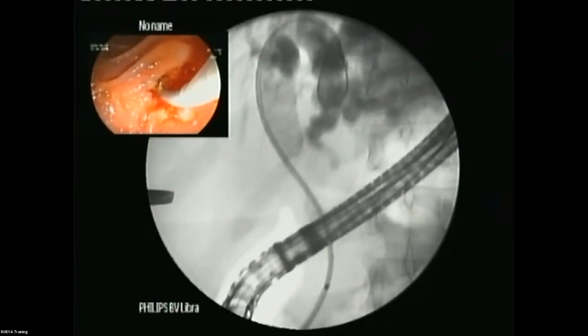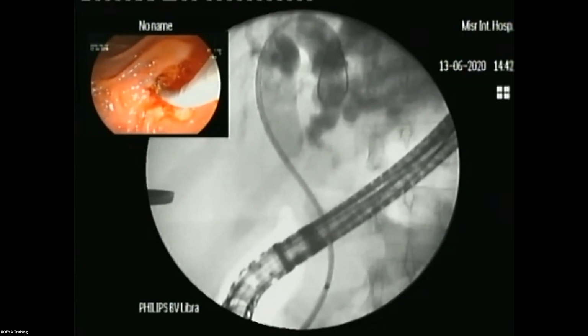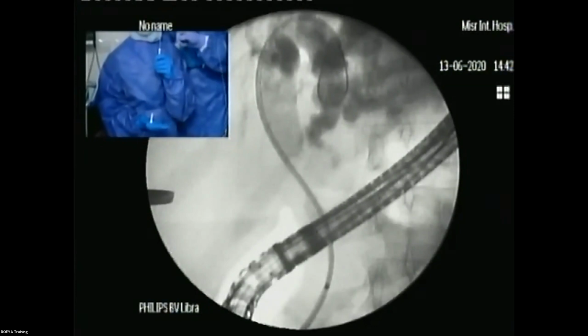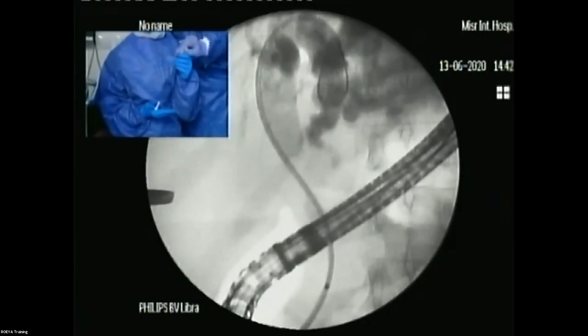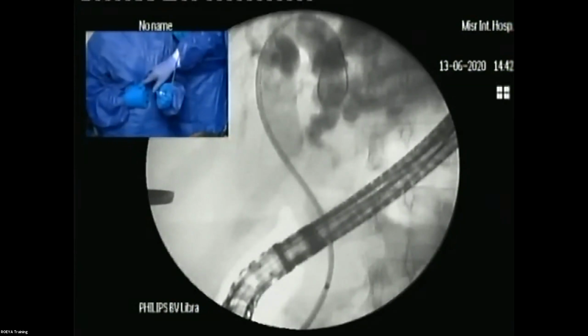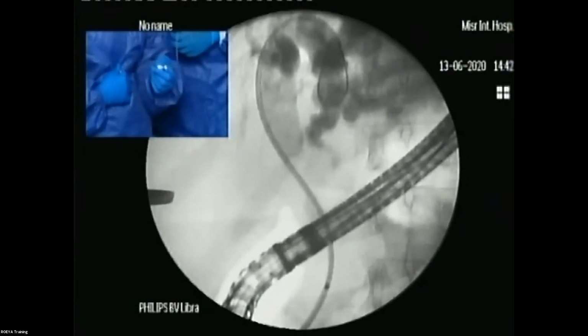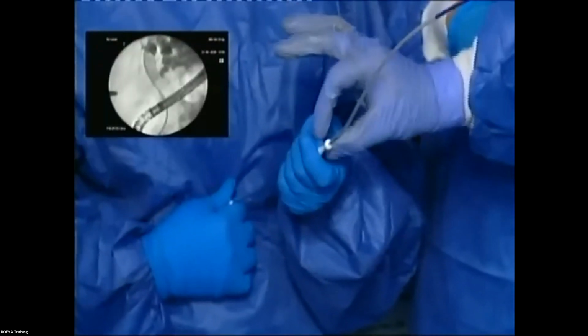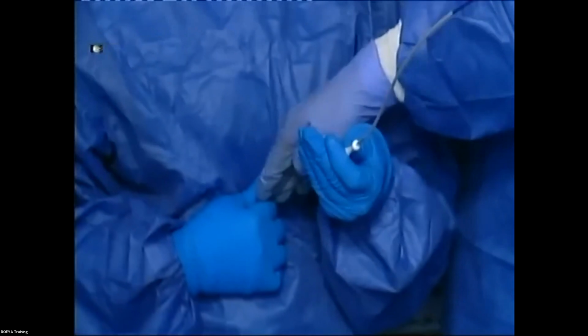Could you get the camera to zoom on Salma's hand? So this is she will show you now how to start opening the stent. So optimally, she fixes this here in her stomach. So this is fixed, and she moves back a little bit. So you have the system straight to reduce the friction. And together, we will start. She will pull here, and this side is fixed.